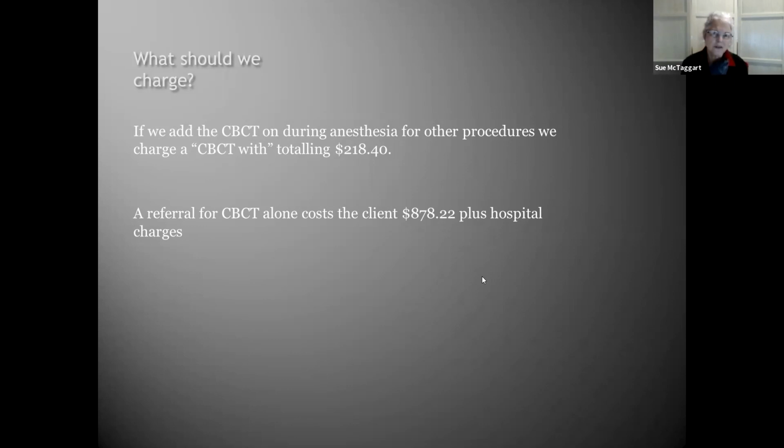So sometimes it's just heavy sedation, other times it's regular sedation with Alfaxan IV, which you could call heavy sedation. There's the odd dog, and we've had the odd one in cats, where I think they cannot breathe at all through their nose, and we will intubate them. You can still do a great scan with them intubated, you just don't get the occlusion quite so well.